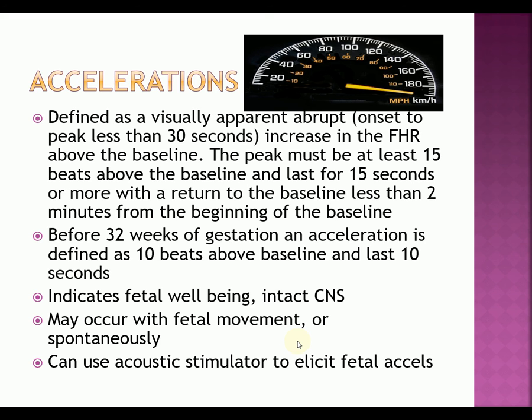The peak itself must be at least 15 beats above the baseline. So if your baseline was 160, the peak would have to be at least 175. It's got to last for 15 seconds or more, and it's got to return to the baseline in less than 2 minutes from the beginning of the acceleration.